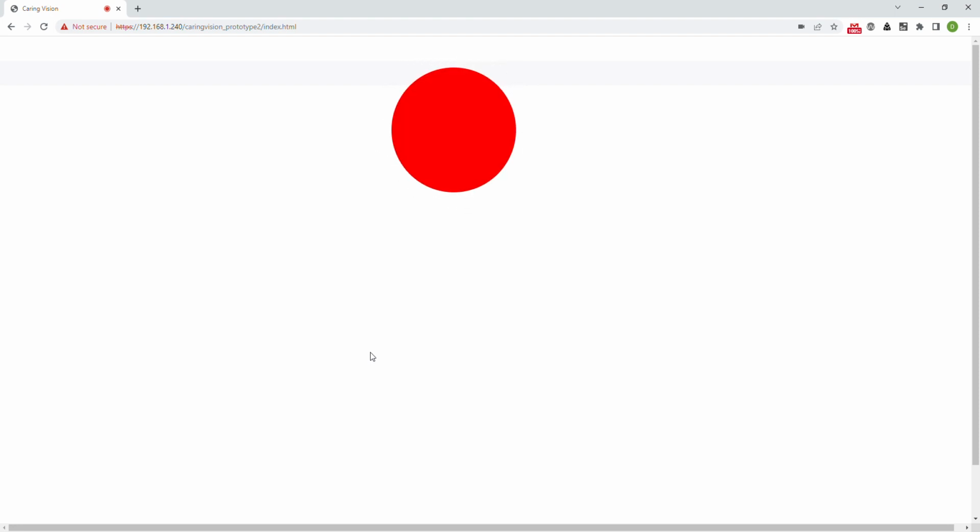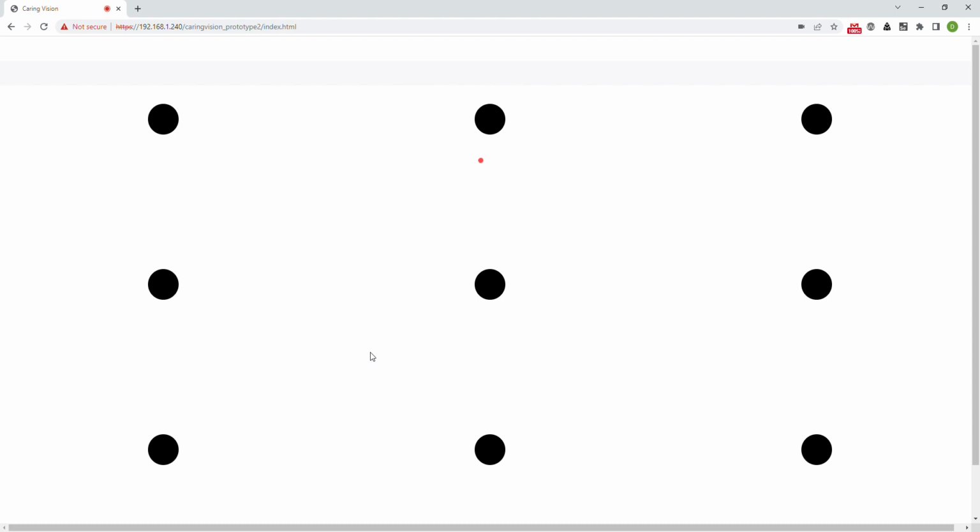You'll soon know when the calibration is completed, because a series of dots will appear on the screen, and that's really there so we can assess how accurate the calibration is. Oh, there it is now. So I'm controlling the little red dot. I'm looking at the top left dot there, looking at the center dot now, and moving on to the assessment now.